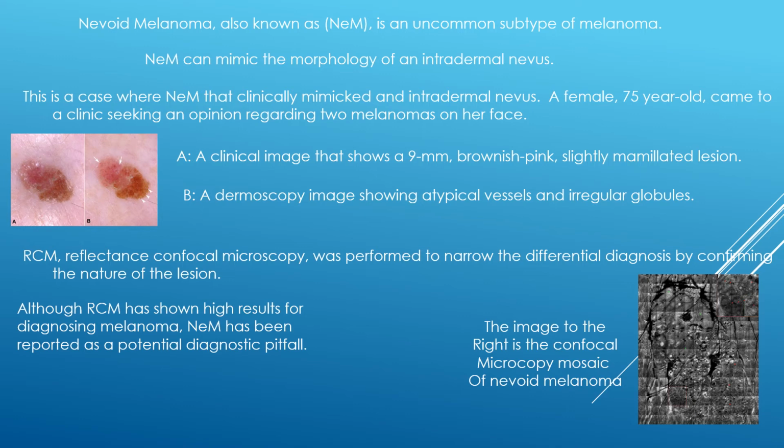So they did an RCM, which is reflectance confocal microscopy, to narrow the differential diagnosis by confirming the nature of the lesions.